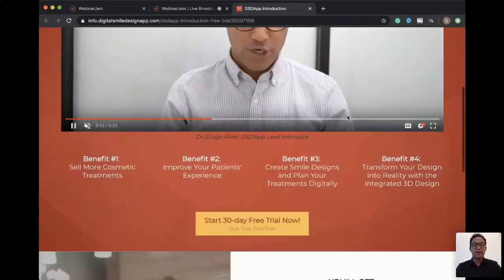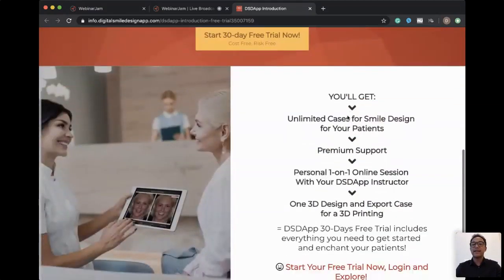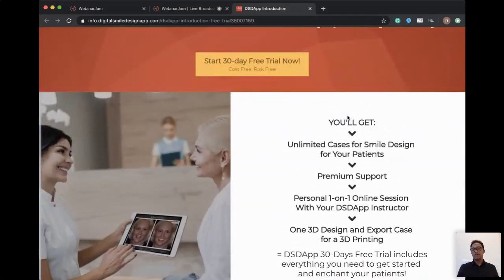You just have to scroll down. And again, it's a 30 days free trial, cost-free, risk-free. You will get all the features just as a gold member: unlimited 2D smile simulations, unlimited 3D smile simulations. You get the premium support, and you will for sure create these harmonic smiles for your patient and get a higher case acceptance rate. So you click on this button that says start 30 days free trial now.